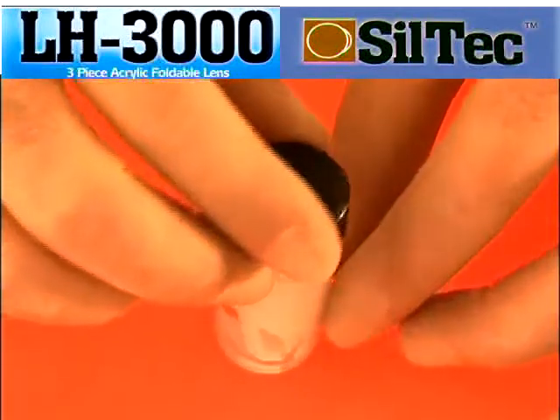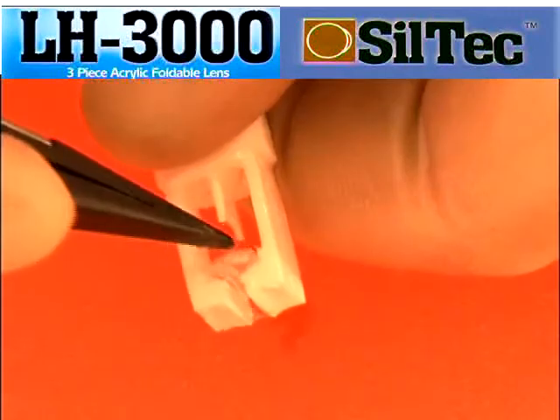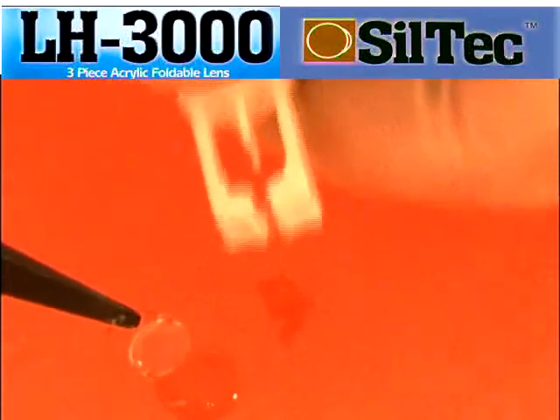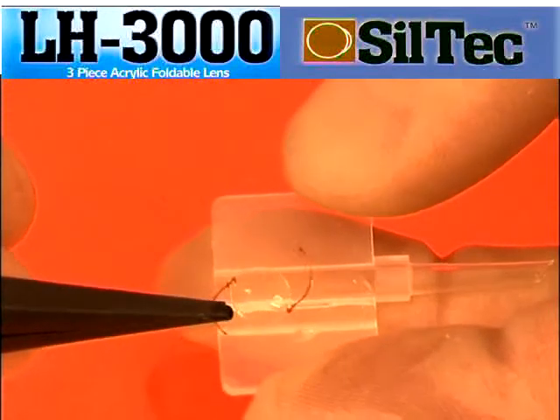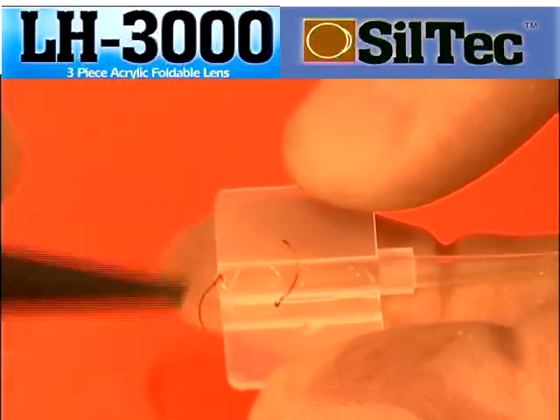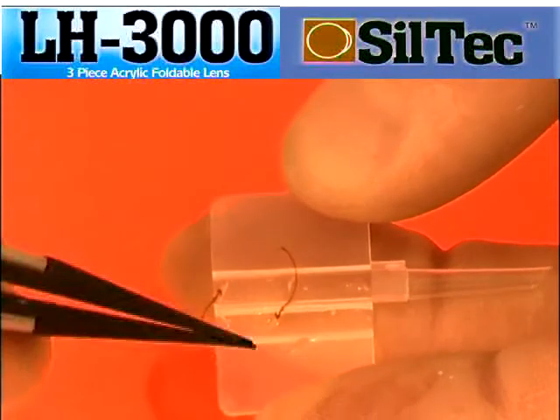To remove the lens, pull the plunger back and take it from its housing using blunt forceps. Place the lens in the middle of the open cartridge with the front haptic curving anti-clockwise. The haptic junctions must be just either side of the centre of the cartridge as shown.